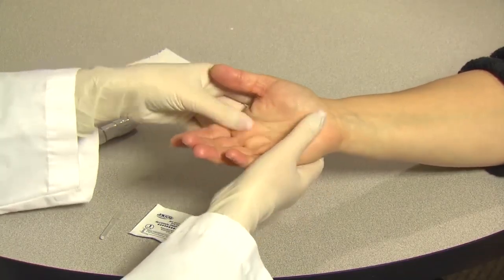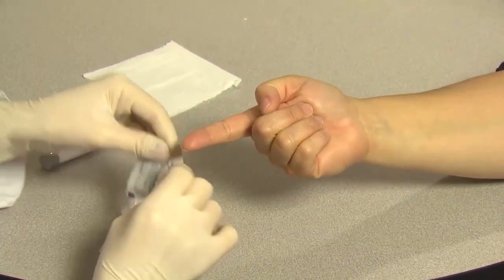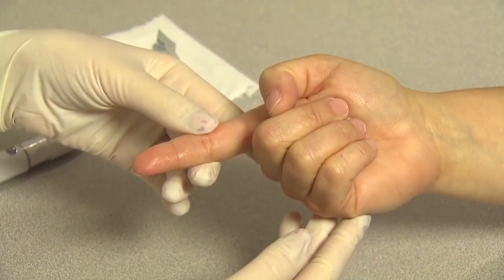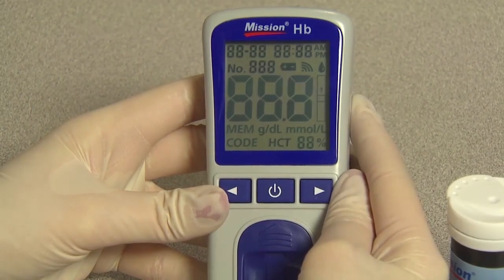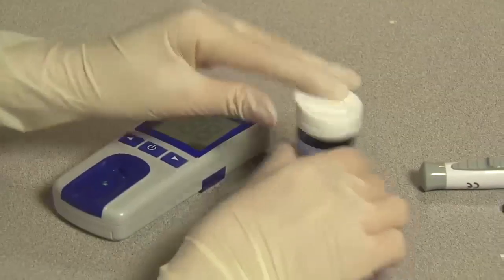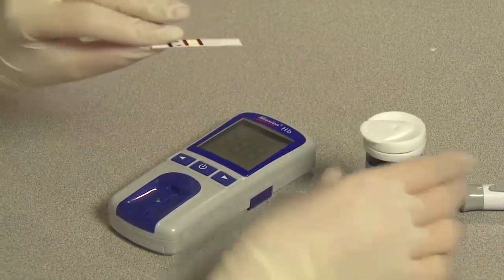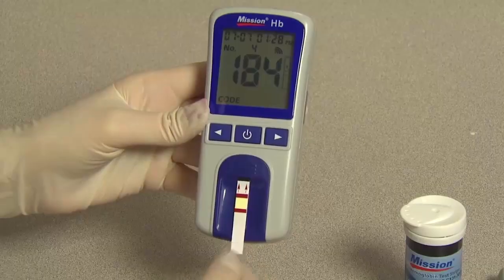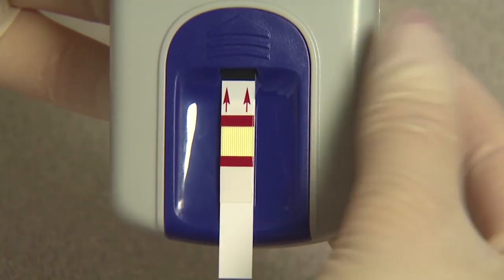Massage the hand from the wrist up to the fingertip a few times to encourage blood flow. Clean the testing site by washing your hands with warm soapy water and then dry them thoroughly. You could also use an alcohol swab to clean the testing site and let it air dry completely before testing. Turn on the meter. To insert a test strip, open the canister and remove one test strip. Make sure you recap the canister after you're done. Firmly insert the test strip into the strip channel in the same direction as the arrows indicated on the strip, all the way to the end until the white edge of the test strip above the black line is no longer visible.